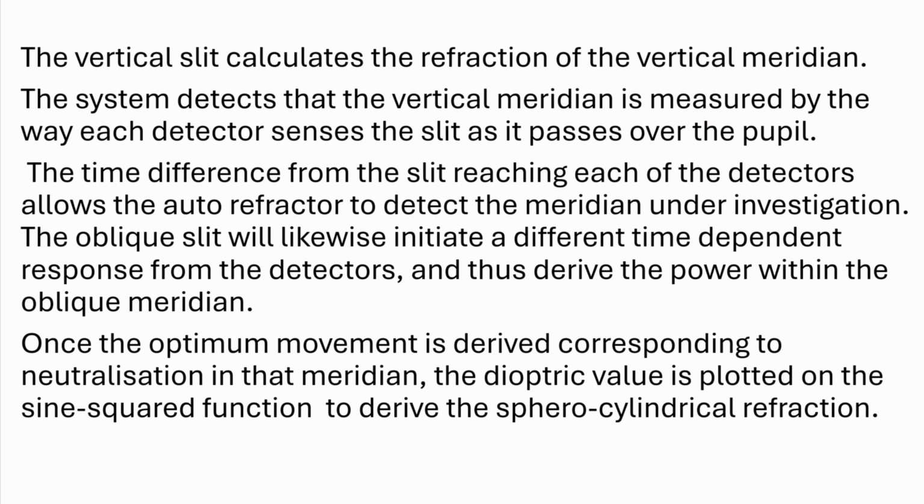Once the optimum movement is derived corresponding to neutralization in the meridian, the diopter value is plotted on the sine squared function to derive the spherocylindrical refraction.